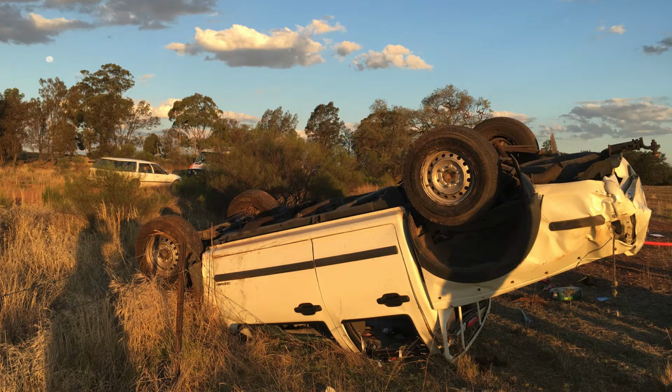As you land at the scene, you are directed towards the driver of this vehicle. Whilst restrained at the time of the accident, he was ejected during the rollover and found himself some 10 metres from this car. He has had a transient loss of consciousness, but is now alert and cooperative, and is complaining of significant right-sided chest pain and air hunger.